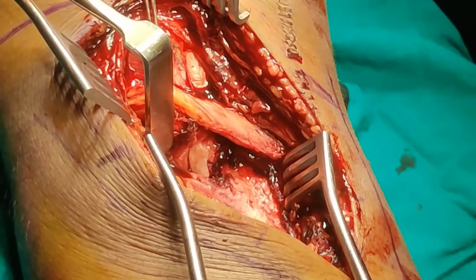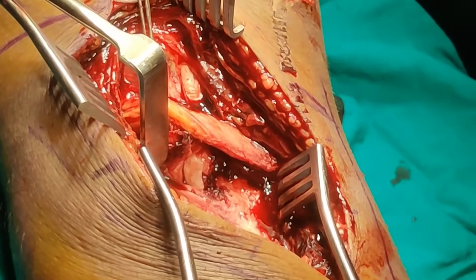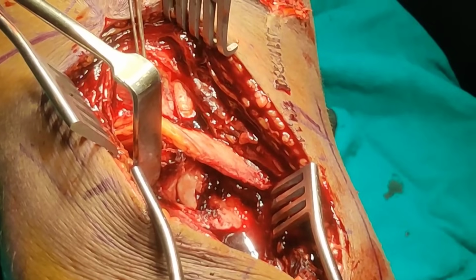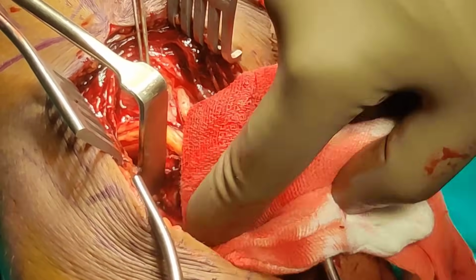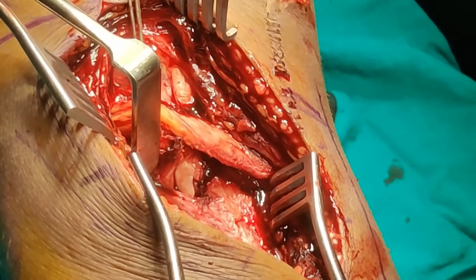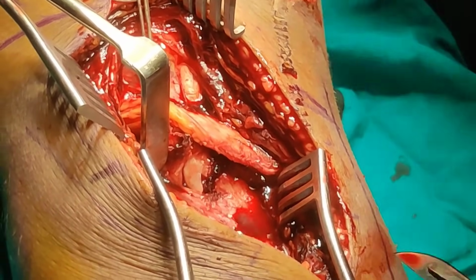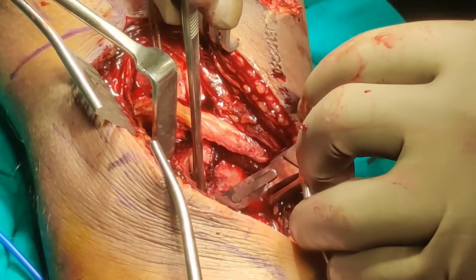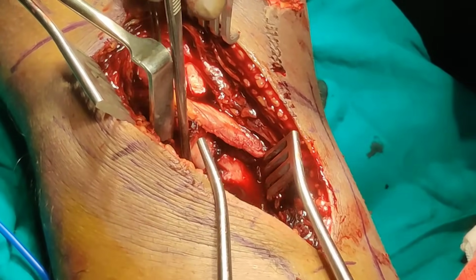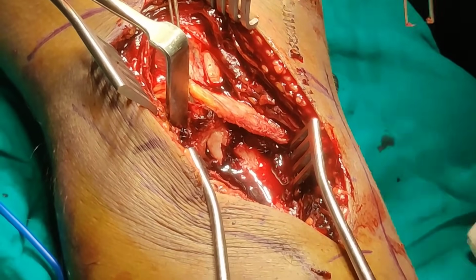Now all we need is, we can use something like a clamp to reduce it, and once we have reduced it, we can use a plate in a buttress mode. So let me just do a little bit more dissection, clear this up slightly so that I can see the shaft. That's it. And then I'm in a position to do my reduction.